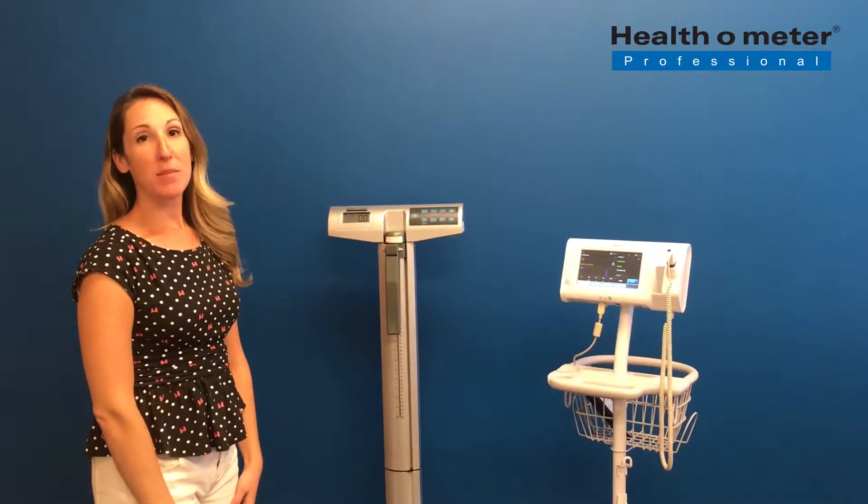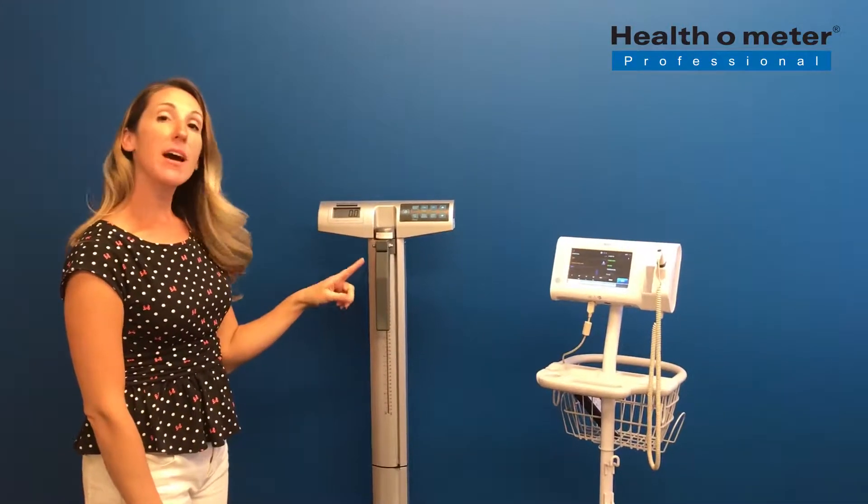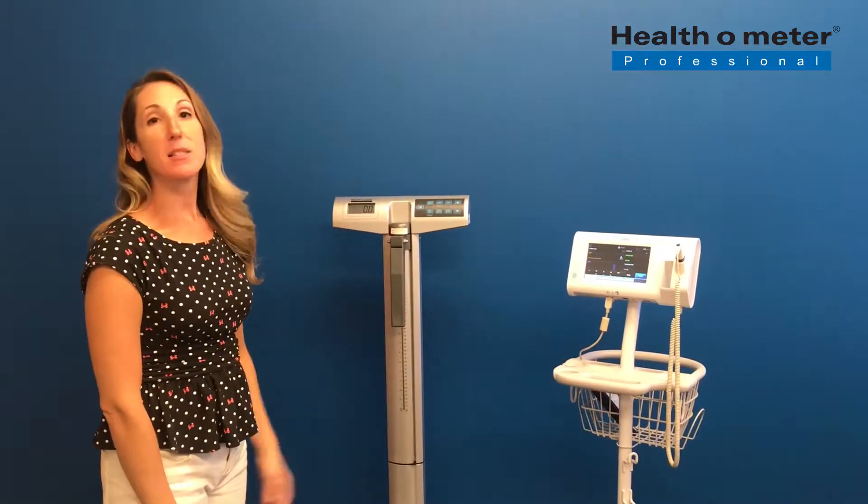Today I'm going to give you a brief demonstration of the Healthermeter Professional 500KLBT transmitting weight, height, and BMI onto the Welch-Allen Connect Spot Monitor.